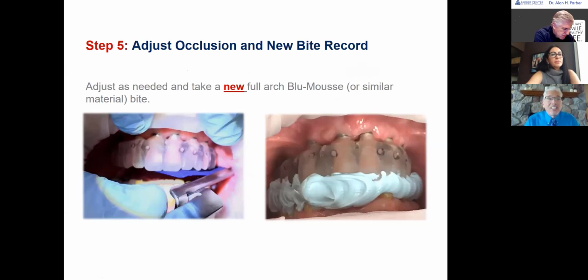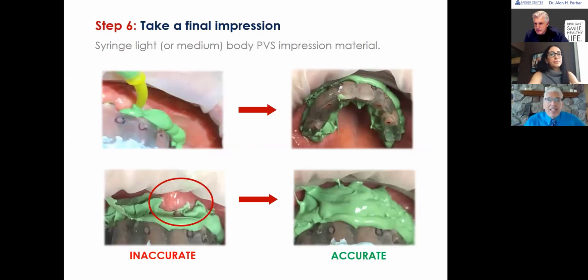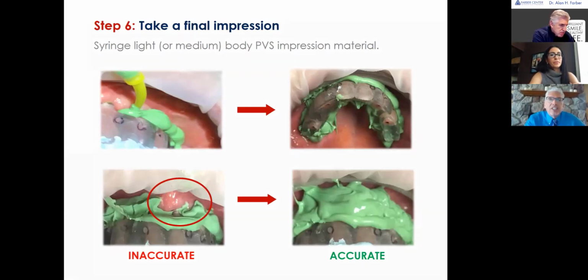We're making the final prosthesis next, right? So we're going to a try-in, but we're on that track. So you haven't taken the clear bridge out. It's still in there. And what you're going to do, because we've created a gap, you're going to take some light body PVS and syringe it from the buccal all the way out through the palatal or lingual. And you're going to capture this healed tissue, the transition line. Do not end up like this. We want to get all of it. Again, we're greedy at the lab. We want to see all this because we want to make a beautiful transition line for you and make it as hygienic as possible.